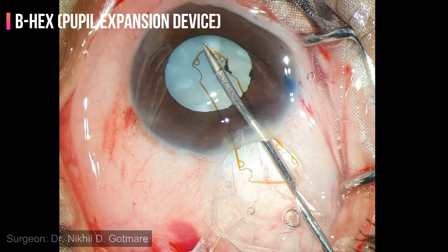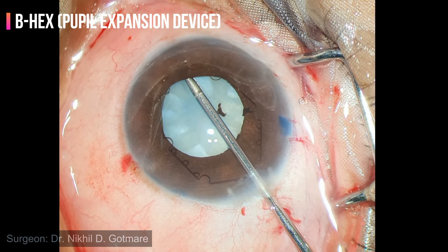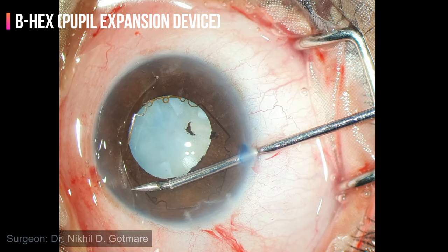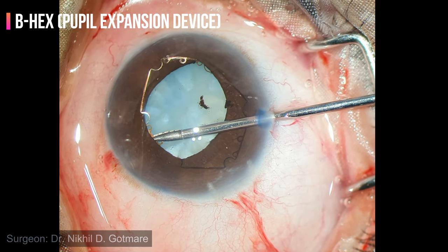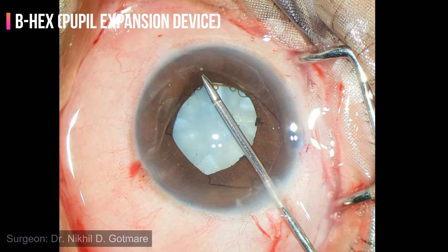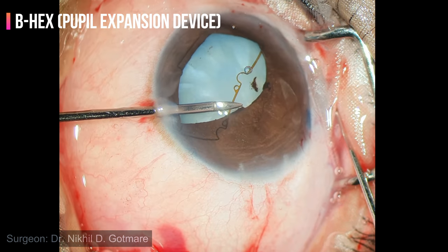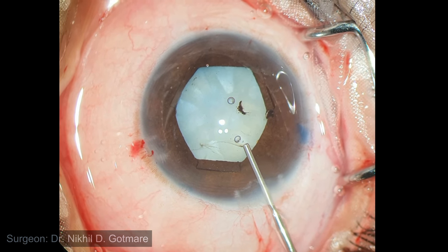The B-hex ring is introduced into the anterior chamber. The leading flange is tucked under the iris. Now the alternate flanges need to be tucked under the iris — each flange is held, pulled centrally, and placed beneath the iris. Main and side port incisions are used to gain access towards the opposite flange. Once alternate flanges are tucked in, we get a dilated hexagonal pupil.